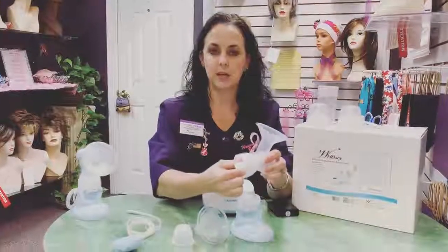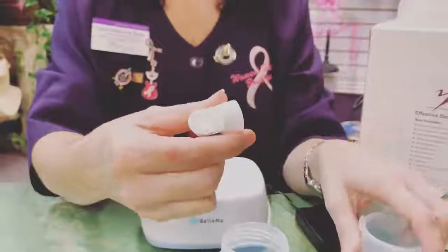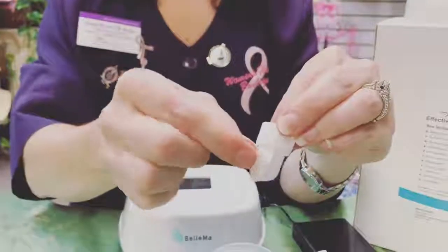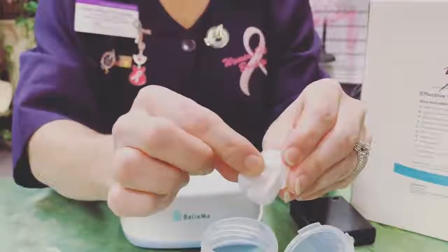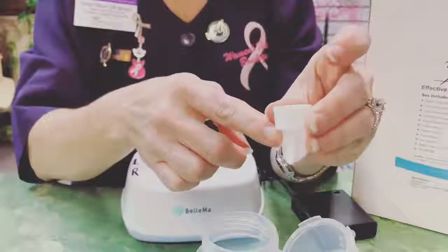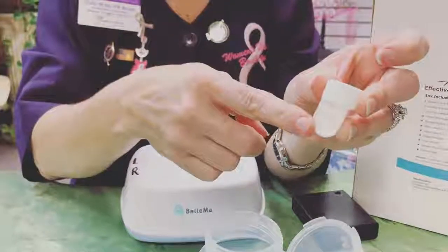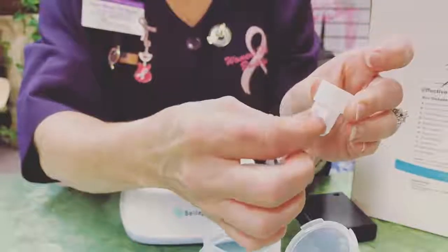The main thing that you definitely want to make sure you clean in any breast pump, whether it's ours or anybody else's, is your valve and membrane. This little white piece pops out. This is where the suction takes place. This little bitty valve flap right here is where the milk drops into the bottle. You want to gently pull this off, and then take a bottle brush over the nipple part and clean the inside and make sure there's no extra milk residue on here. If you get a bunch of milk buildup, it will cause it to lose suction.